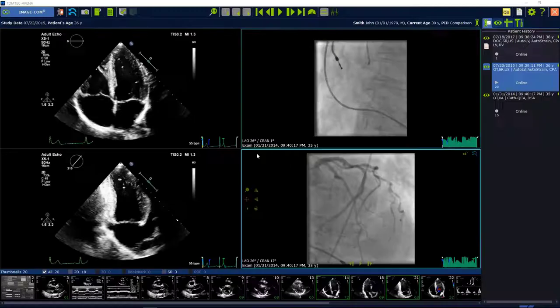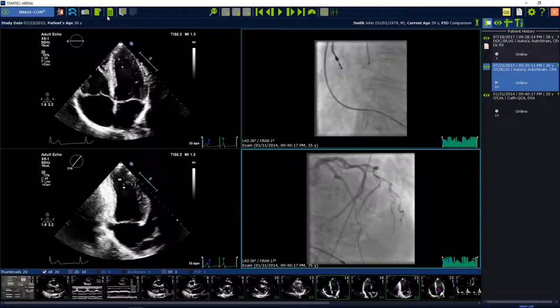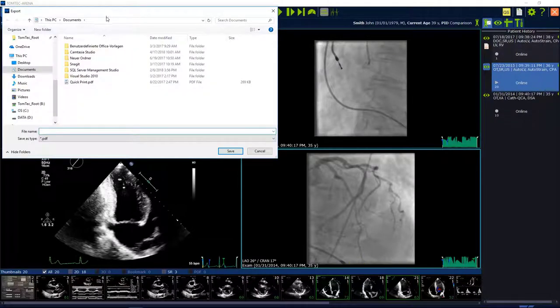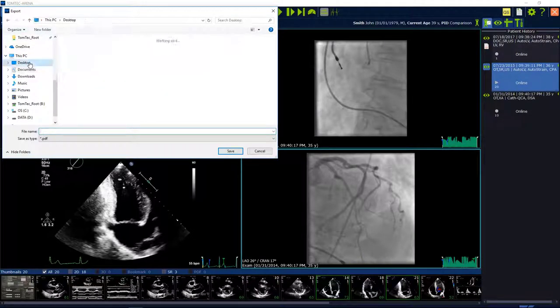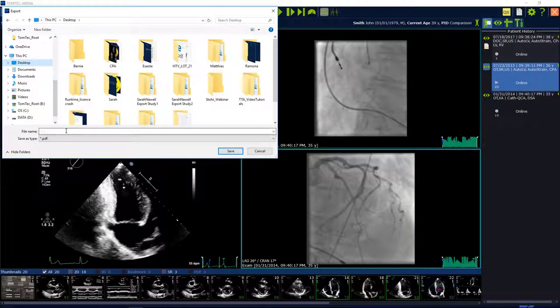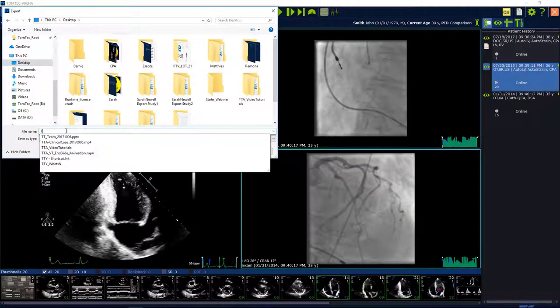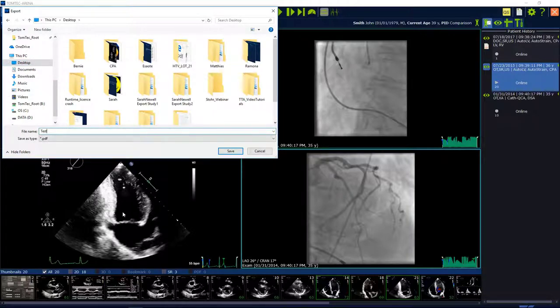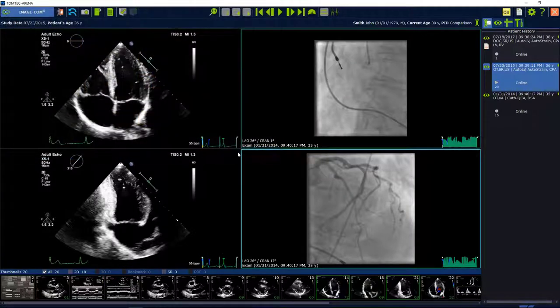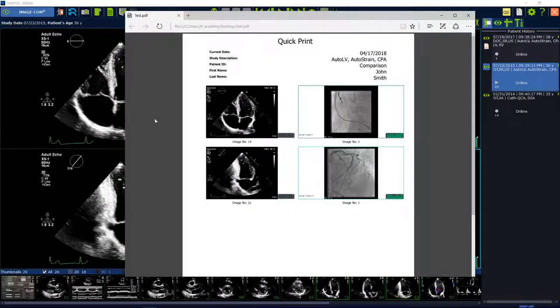PDF quick print: by pressing the PDF quick print button on the top of the toolbar, all images which are visible in the image area will be exported in a PDF file. To include more images, change the layout of the image region.